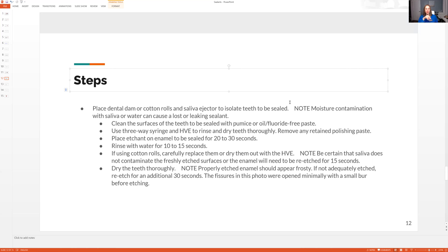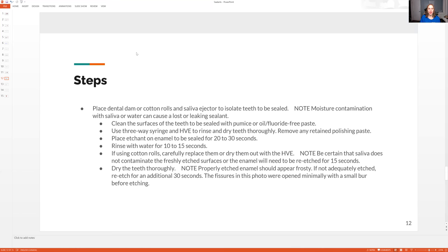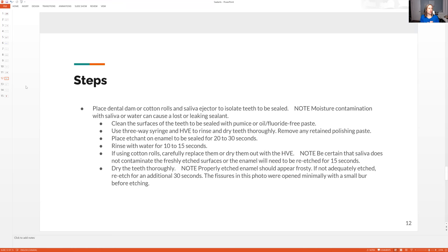Check to make sure that the sealant's not going to pop off with your explorer. We make mistakes — we can't be perfect — but if it pops off, you've got to go through the whole process again. Those are the steps. Easy, right? So much easier than the patient getting a cavity and having to come back for a filling — they're going to need a needle, the dentist has to prep the tooth, put on a rubber dam. Sealants are so much easier.